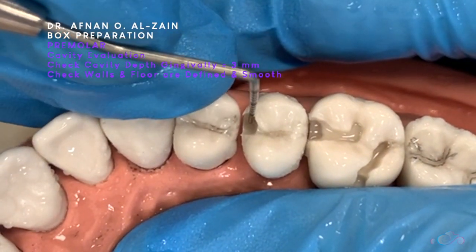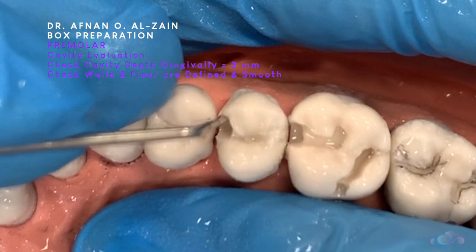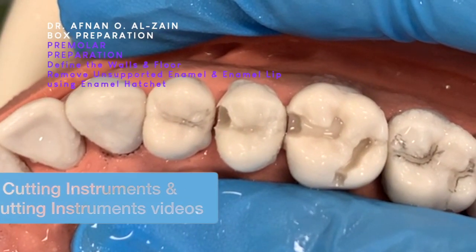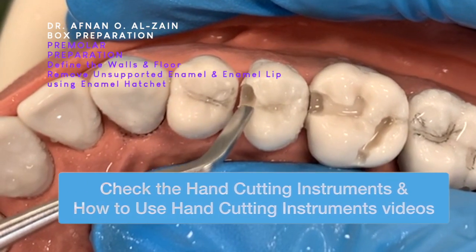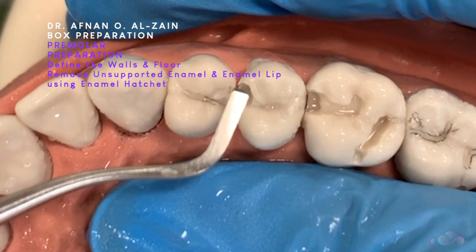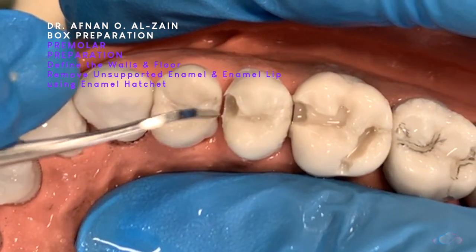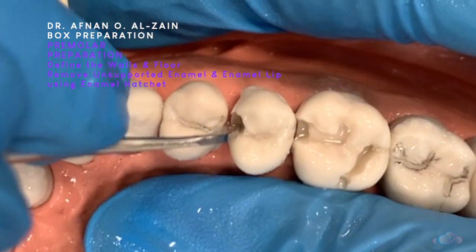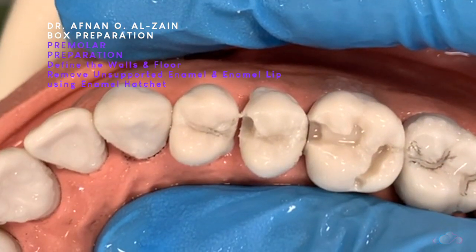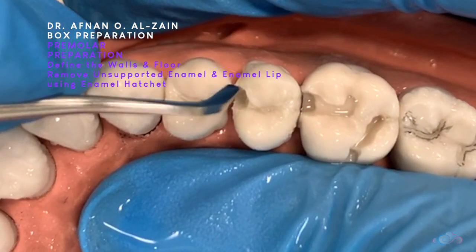We're going to check the depth. We're going to use the enamel hatchet to continue breaking the contact. We're going to start with the lingual — chopping action. Then we're going to use the other side to the buccal wall.